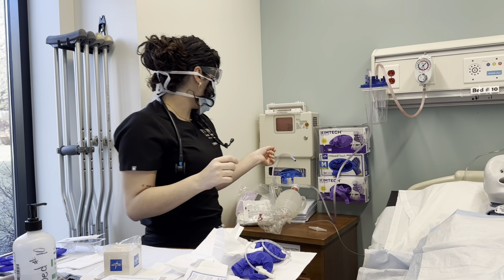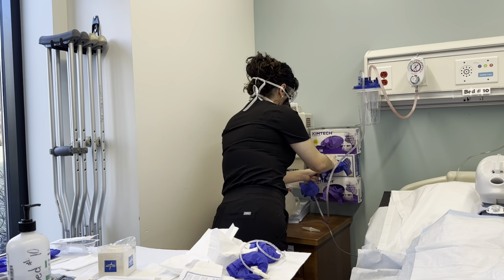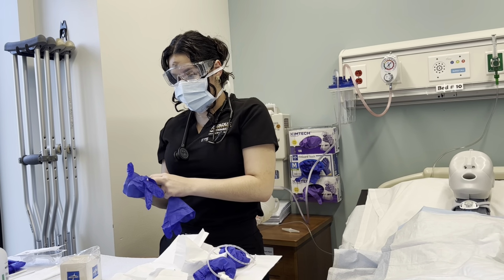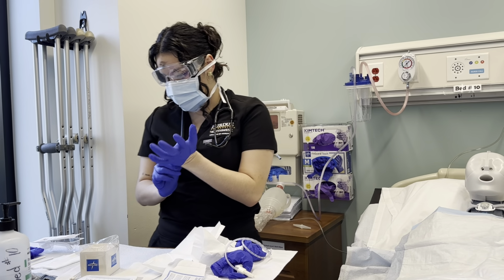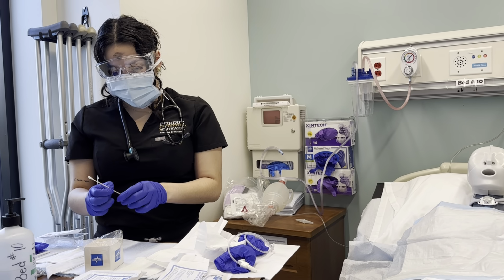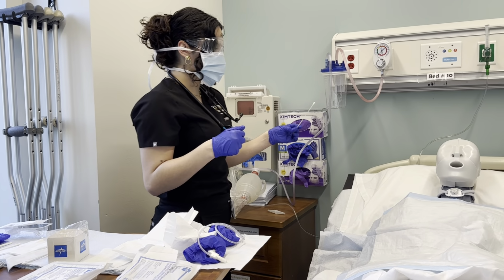Now I put on a clean pair of gloves. I'm going to take some cotton swabs and I'm going to dip them in the sterile saline, and I'm going to cleanse the stoma in 4 different quadrants.